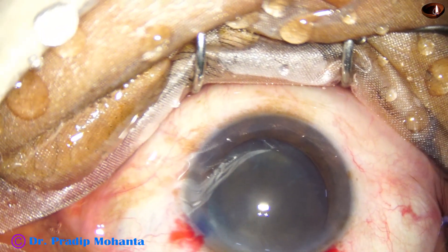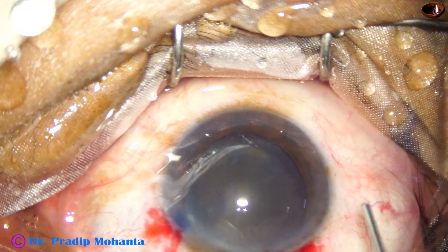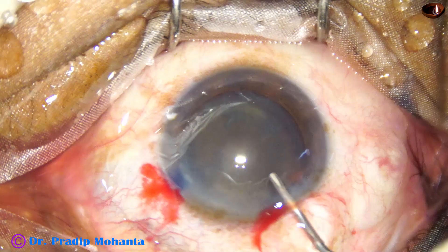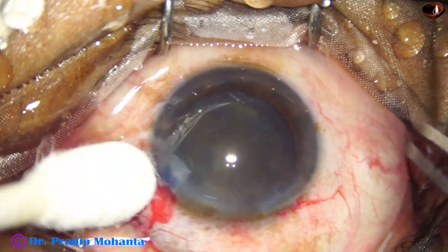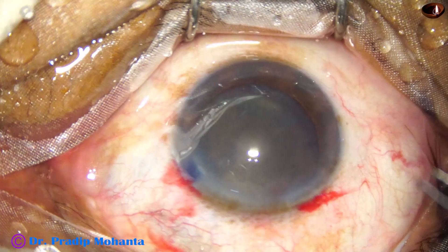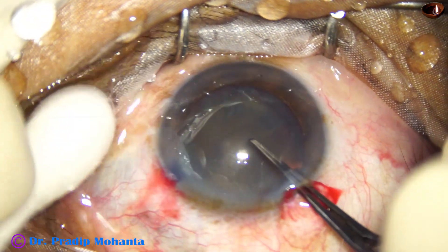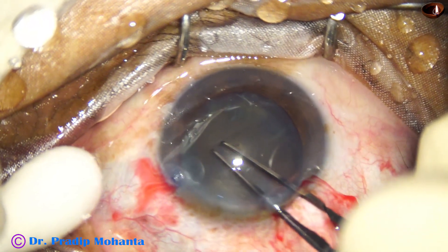Now fill up the anterior chamber with two percent hydroxypropyl methylcellulose. In hard cataracts we can use the soft shell technique, where the anterior chamber is under-filled by sodium hyaluronate and chondroitin sulfate combination, and beneath this compound, sodium hyaluronate is injected.